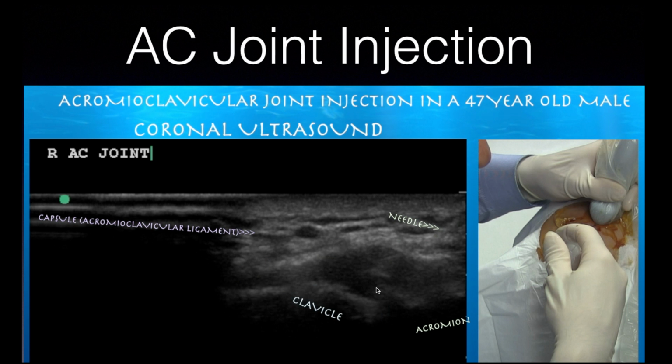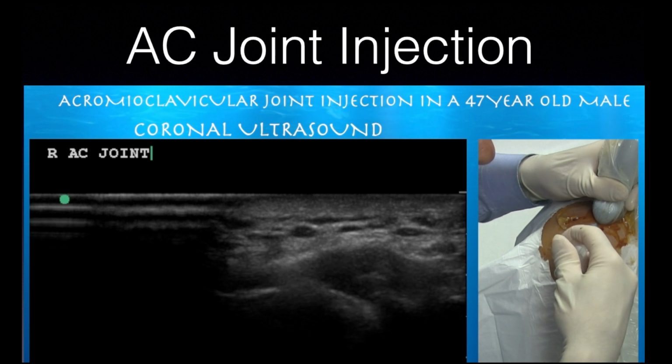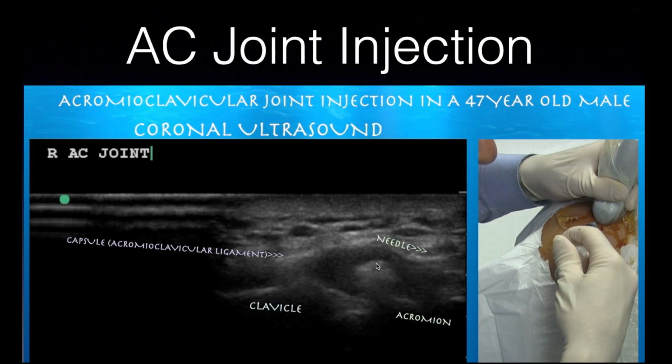A good approach for any joint is just to go to the least painful part of that joint and then inject it. That's one of the advantages of ultrasound. And then I'm just injecting, and you can kind of see that air within the injectate.